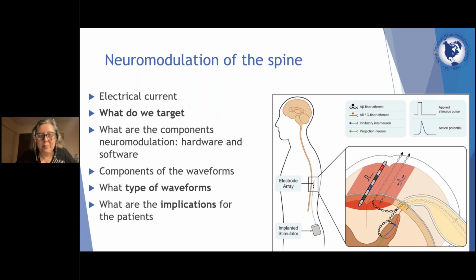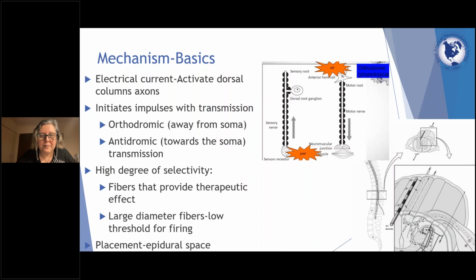So we talk a little bit about the neuromodulation of the spine, what specifically we target with our neuromodulation, the types of waveforms we know, and we guess and study the mechanism of action, and a little bit about implications to the patients.